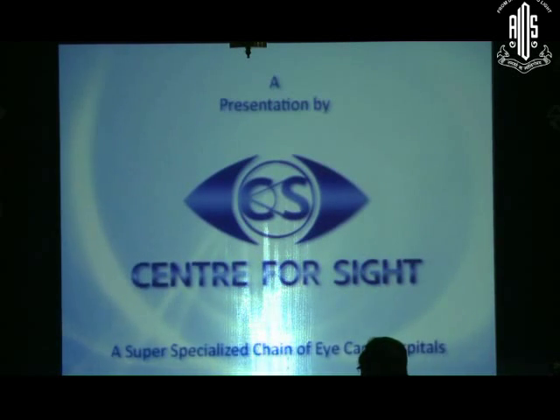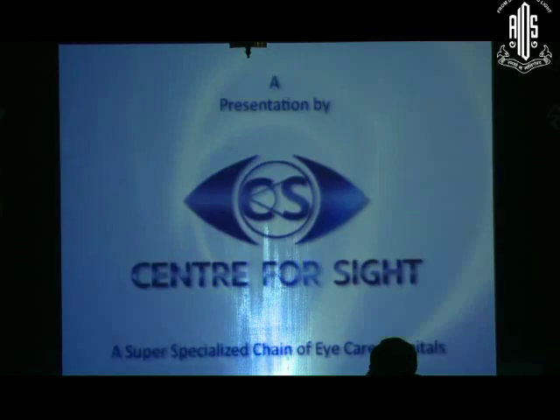So friends, these were a couple of cases that I just wanted to show you: the technique of glued IOL, the technique of IOL scaffold, and also telling you do not become lax. There are a couple of places where I showed laxity, where you just push the lens or you use parameters which were not good in case of a subluxated lens, and how to manage them.